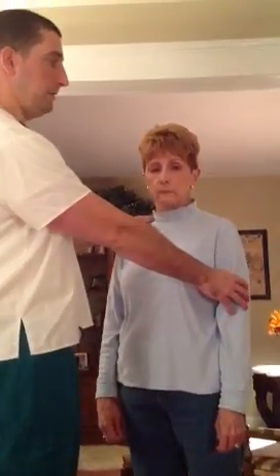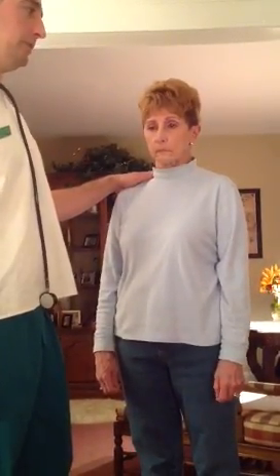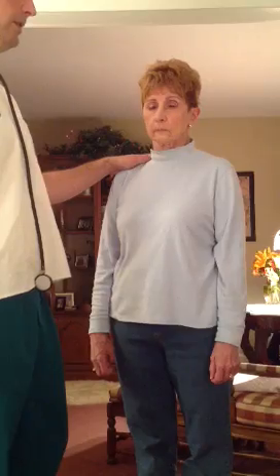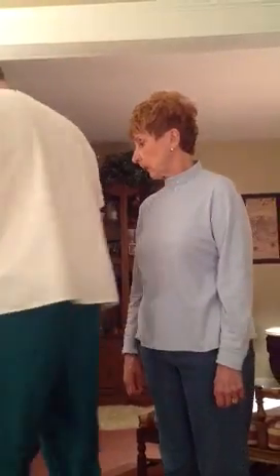So now, when I would be assessing her blood pressure, once again, I'd put the blood pressure cuff on her arm right above the brachial pulse, 1 inch above. The systolic phase would begin with the first heart sound, the S1, and the closure of the mitral and tricuspid valves, which would be the AV valves. Now the diastolic phase would begin with the second heart sound, the S2, the closure of the aortic and pulmonic semilunar valves. Okay, so now I'm going to listen to your lungs, your bowels.